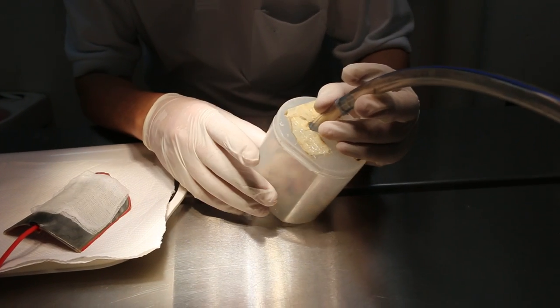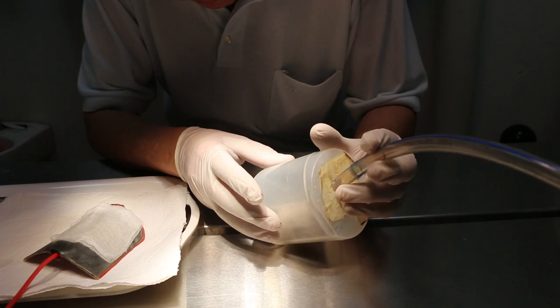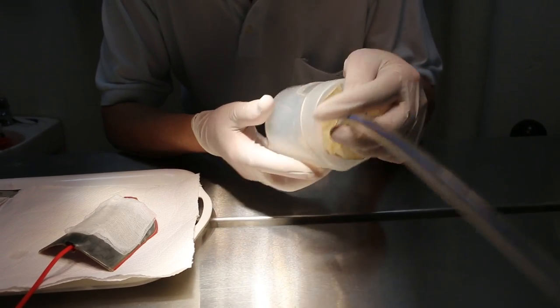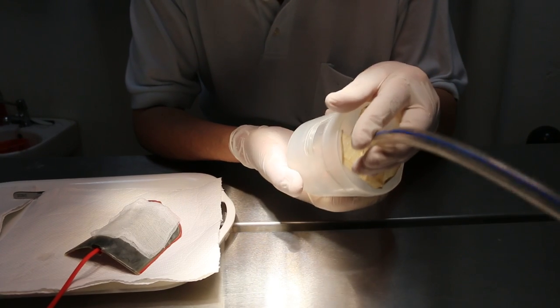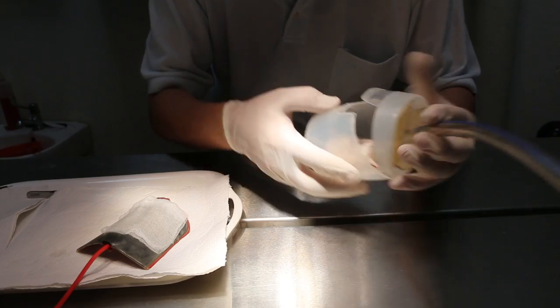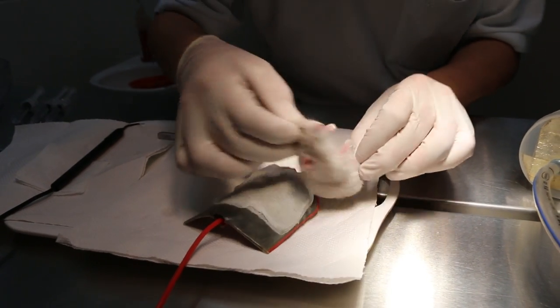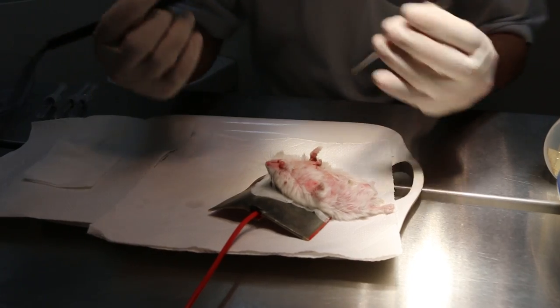Do again, because for gas, anaesthesia of a hamster is very, very short. It's not very long. And it's very hard to tell exactly when they are down, but you can see the eyes are closed. So when the eyes are closed, it's down, but not too deep, you see. So I quickly cut off the wart.